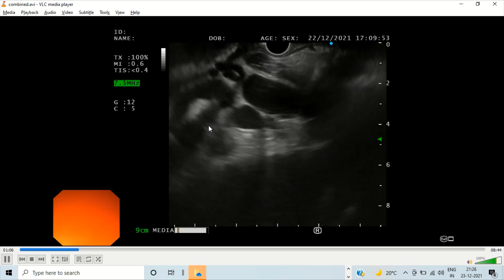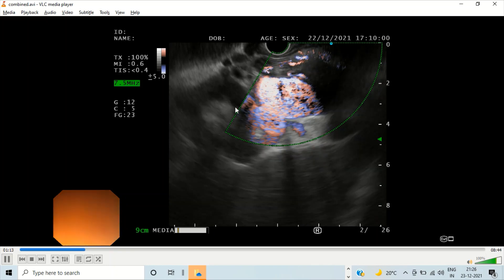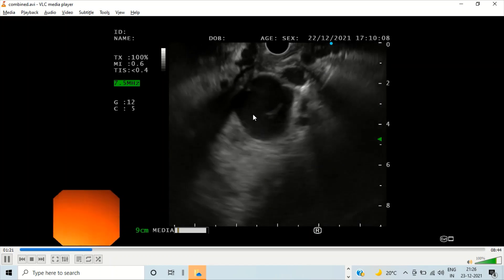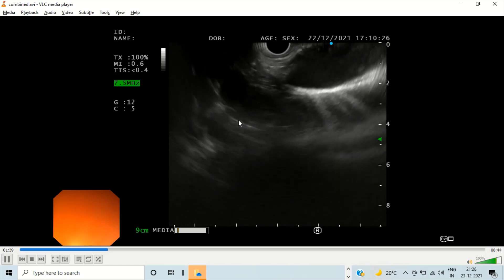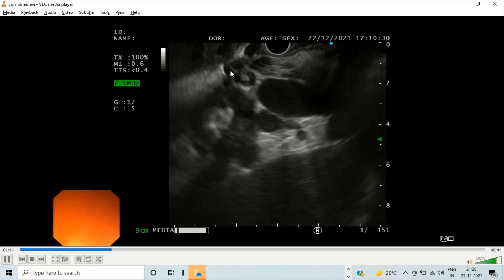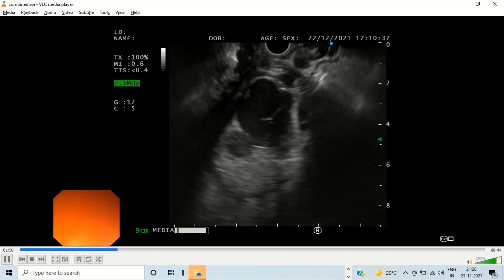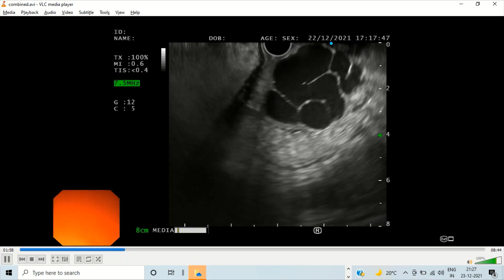Let us trace out the perforators — the feeding vessels to the gastric varices. Here we can see the gastrorenal shunt; all the black things you see are the blood vessels. As we remove the Doppler, we find that this gastric varix is being supplied by afferents coming from the gastrorenal shunt — this appears to be the main feeder. There are basically multiple feeders and multiple afferents originating largely from the gastrorenal shunt. However, one important point is that this is not what we will be targeting. Our target will be the variceal conglomerate that is surrounded by the stomach wall.